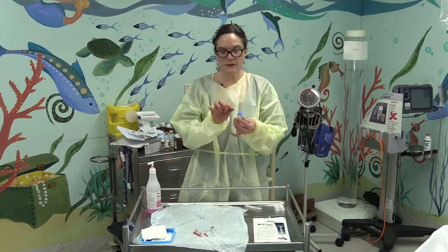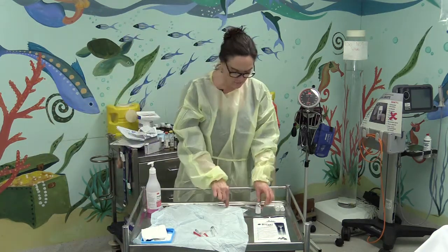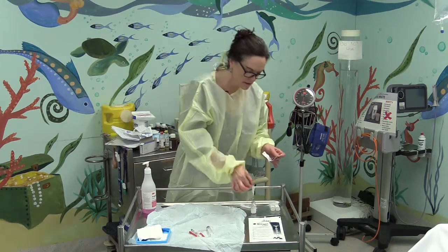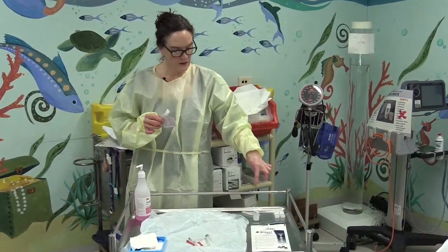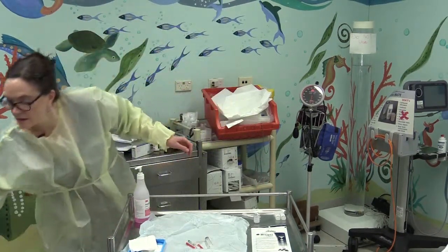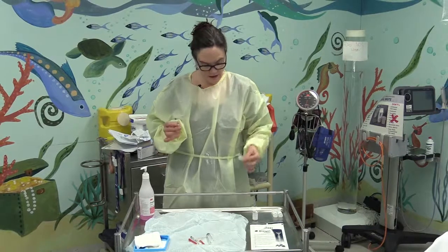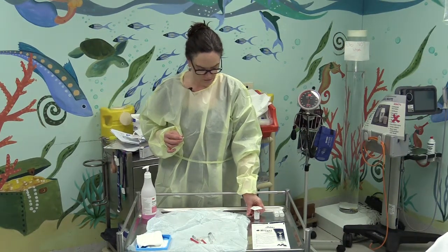I'm just going to flip the lid of the cephalothin and cover it with an alcohol wipe. And that just prevents dust or droplet bacteria from settling on the rubber cap while I'm washing my hands. And I'll twist off the gentamicin cap, and I'll just put it so that it's just sitting on the edge of my sterile field.